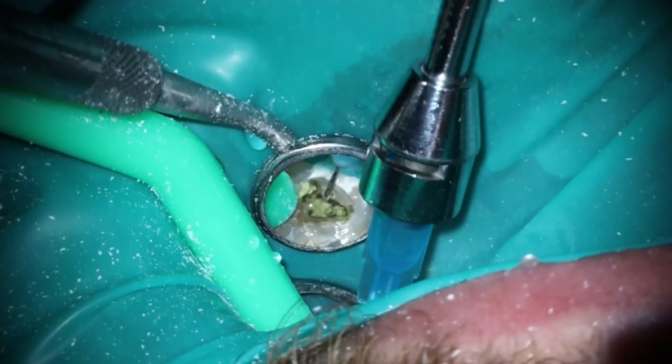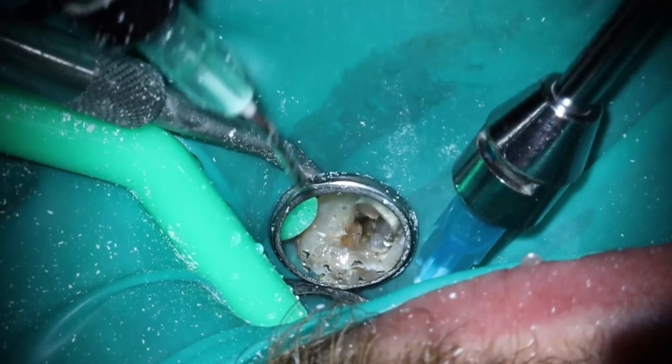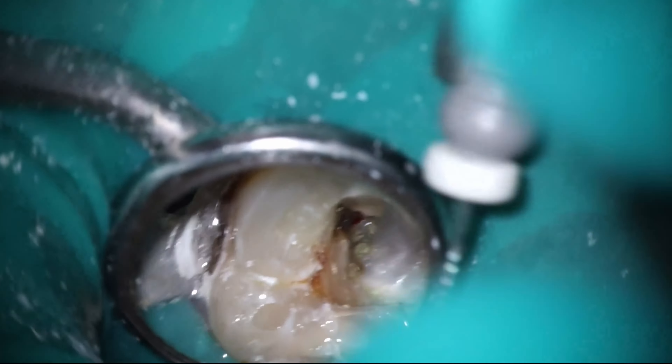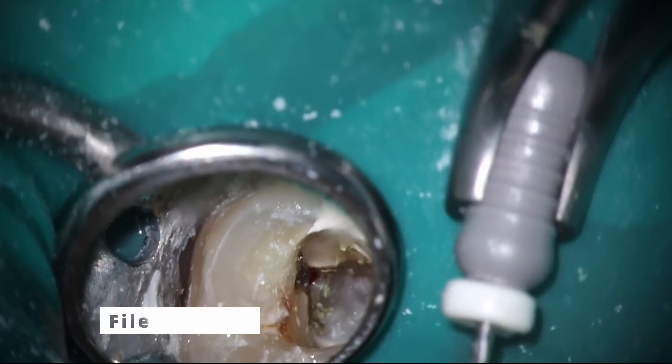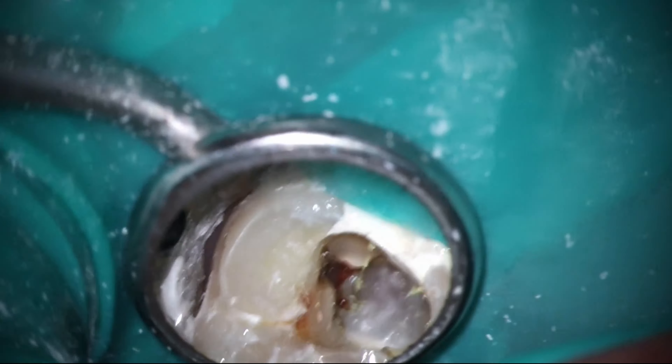That color right there should give away what the material is that was inside there — that plus how radio-opaque it was. They used Vitapex as their temporary medication instead of calcium hydroxide. The fact that they put it down into the canals like that is amazing. Oftentimes I see when general dentists have started cases that they don't put anything inside there. That would be one thing not to do. Even taking some calcium hydroxide and squirting it just on top of the canals is going to help make sure there's no bacteria present.